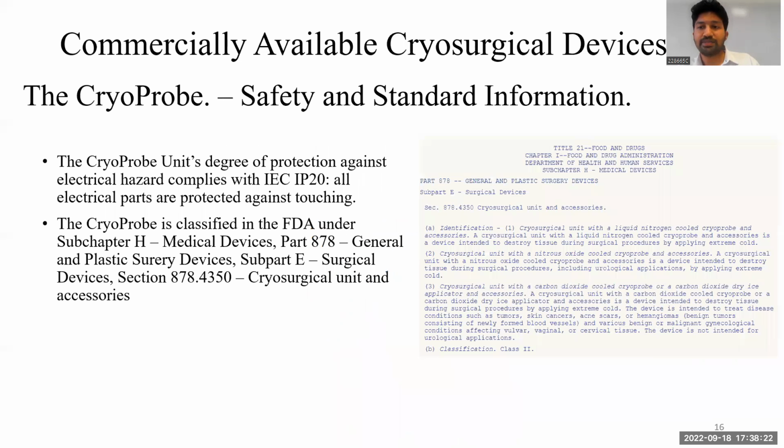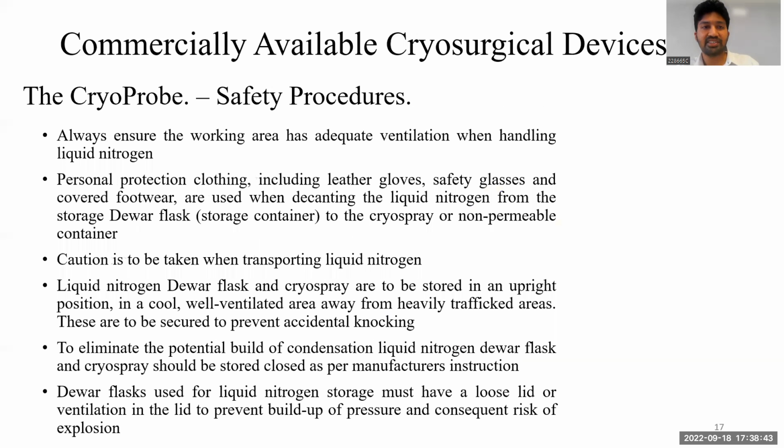So if you talk about the safety standards used in cryoprobes, the cryoprobe's degree of protection against electrical hazards complies with IEC IP20, and it is also FDA registered under section 878.4350 for the cryosurgical unit and accessories.